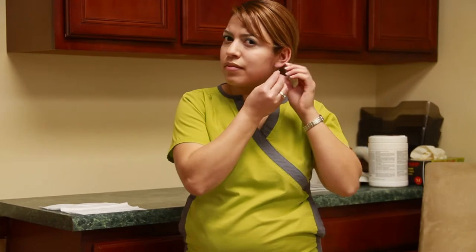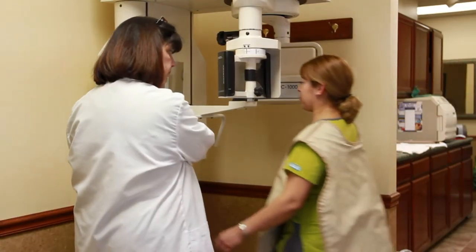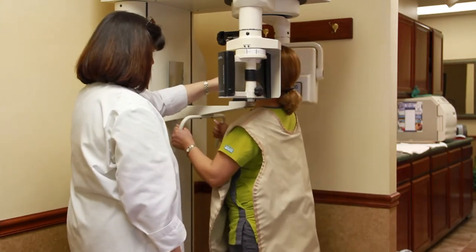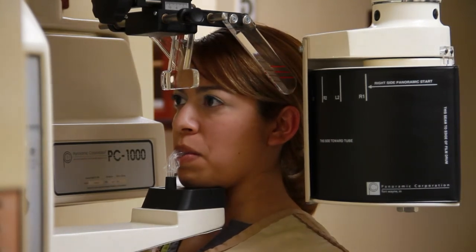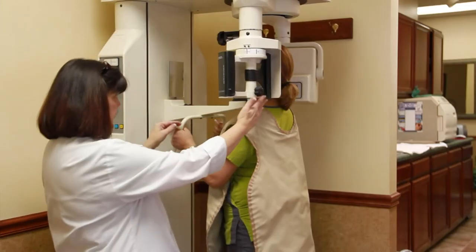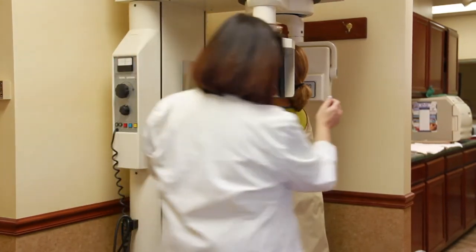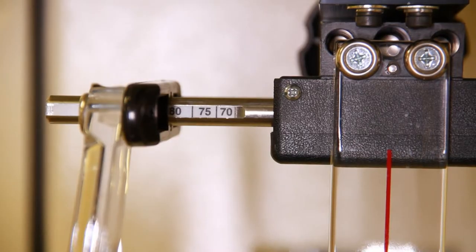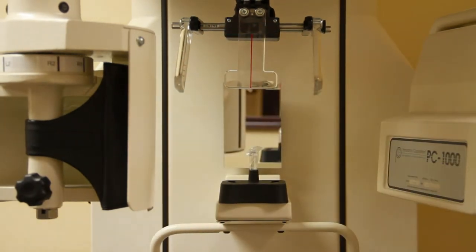After you explain the reasons and the safety for the x-ray to your patients, start by having them remove all jewelry or metal objects located on or around the head. They will need to wear a lead vest. If your patient has had thyroid surgery or has a thyroid condition, a special collar will need to be worn. Next, have your patient step up to the x-ray machine platform, placing their chin on the rest and their teeth in the bite groove, adjusting the height so that the chin is parallel to the floor. Make sure there are no obstructions between the area being x-rayed and the film. Now adjust the temple plates to secure the head from movement. The sensitivity measurement on this plate will be used in a moment, and you may need to have the patient step out in order to get this number.